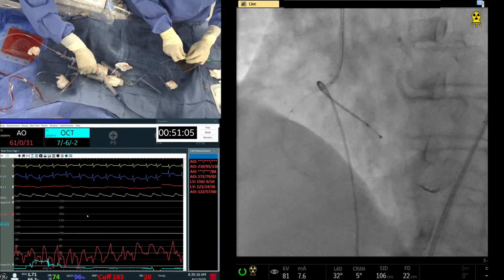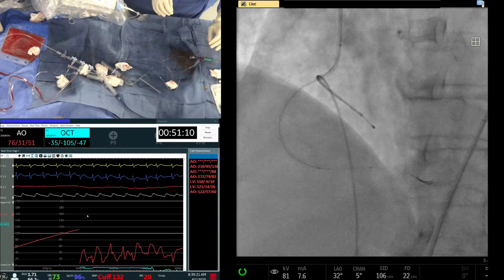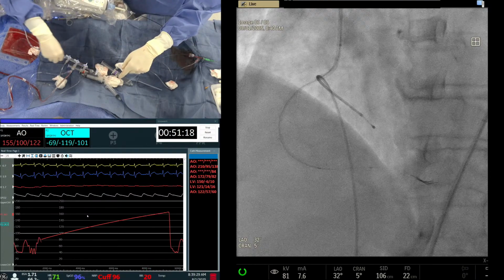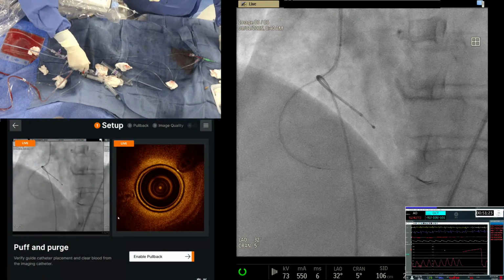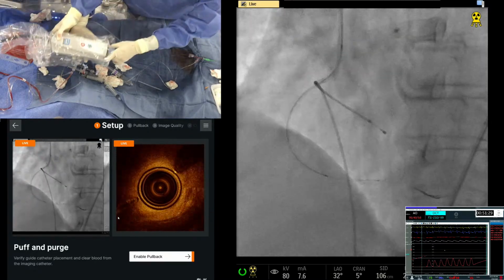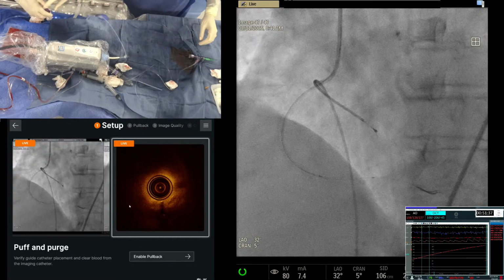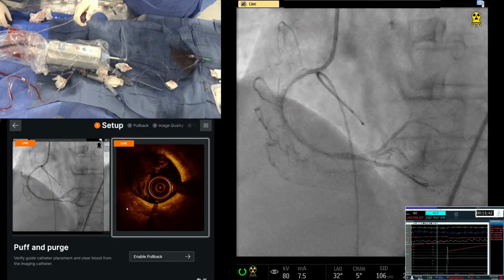I would say let's just use hand, because this thing is not giving us a good injection. Why don't we see pressure here? Maybe we can show the OCT. You should see pressure when you close it. No, when we inject, I understand what you are saying. Okay, thank you. So now see, what you're doing is purging. So what we normally do is check the path from the guide, and then some dye. So you repurge with the small syringe. Yeah, nice. Okay, good.